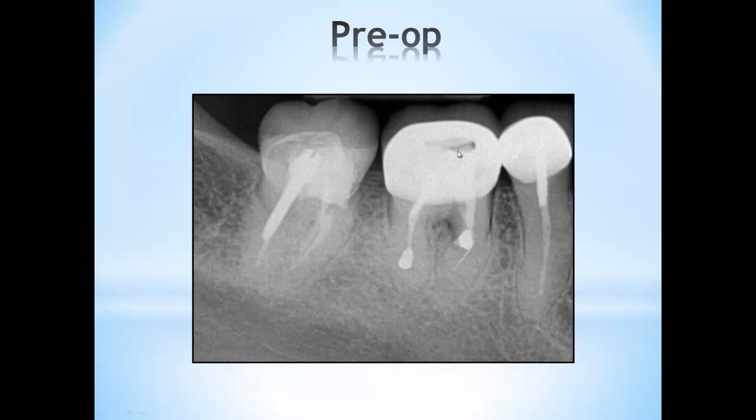And also we can see that probably the root canal originally failed, and the patient went to an oral surgeon where an apicectomy was done. I told her that number 30 has a questionable prognosis, and she was aware that if anything happens during this procedure, we might extract number 30 and maybe place an implant, or we'll do a 3-unit bridge here.